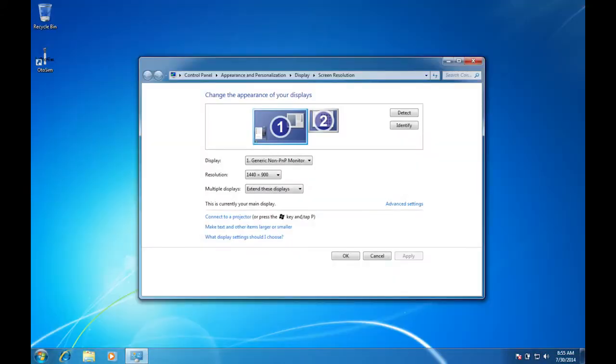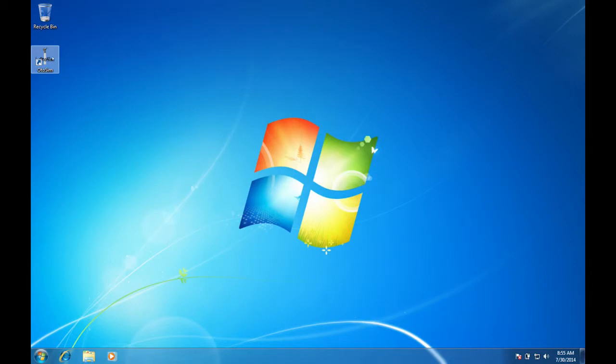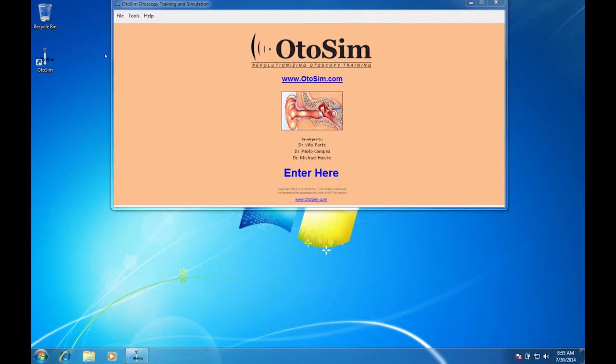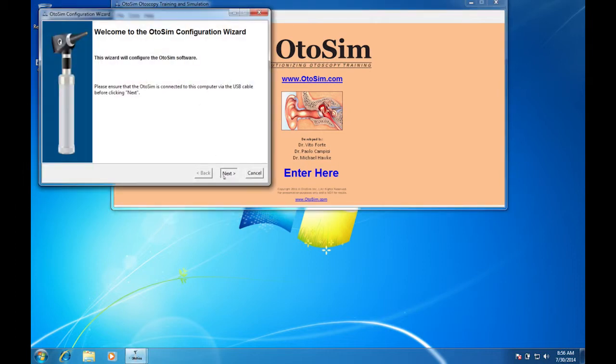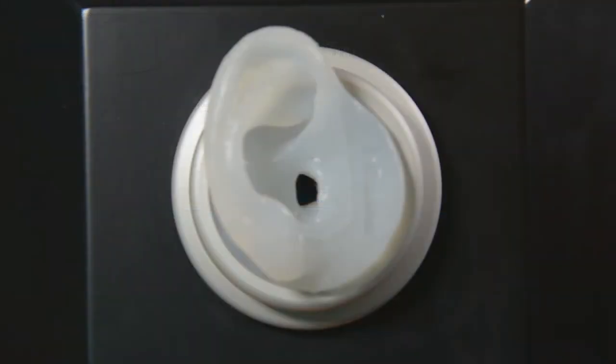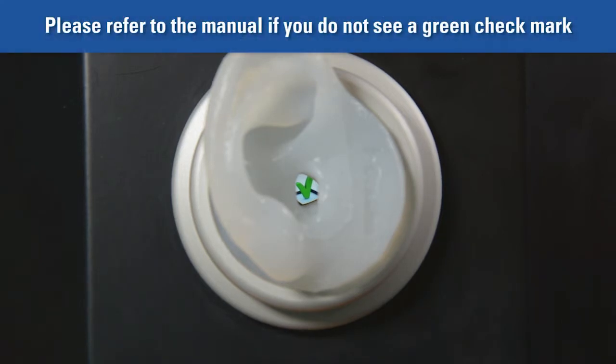Testing the OdoSIM display unit. Open the OdoSIM software by double-clicking on the OdoSIM icon from the computer desktop. From the top left side, click on the Tools menu and select Configure OdoSIM. Follow the prompts. Once you click Test OdoSIM Unit, please look into the unit with an otoscope. You should see a green-colored checkmark. This confirms that the unit is ready for use. If you do not see a green checkmark, please refer to the product manual for the Technical Troubleshooting section. You can always contact us should you need further troubleshooting assistance.